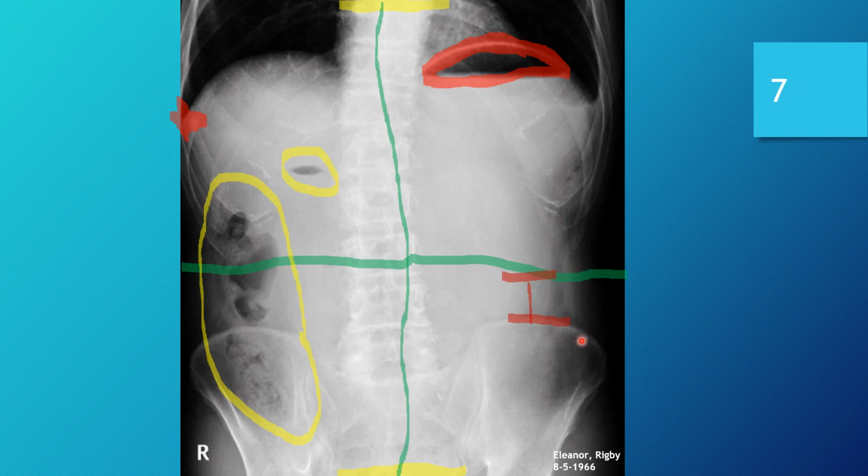That could potentially be from a skin fold or perhaps clothing, but it's very, very minute. So artifacts, the image is definitely free from those.